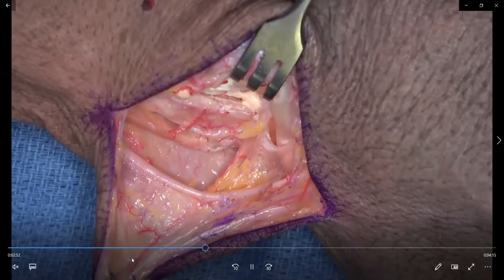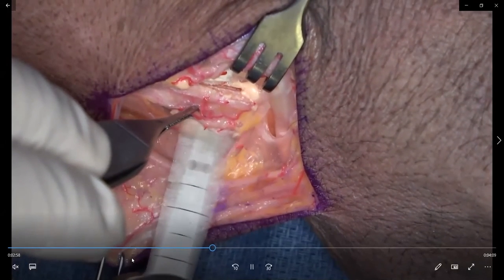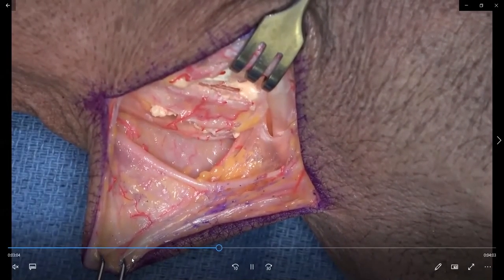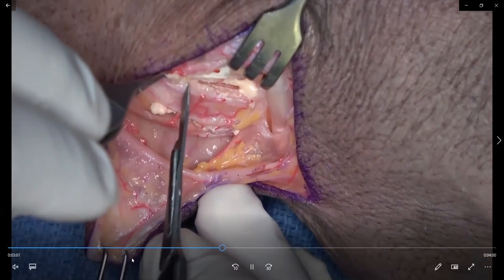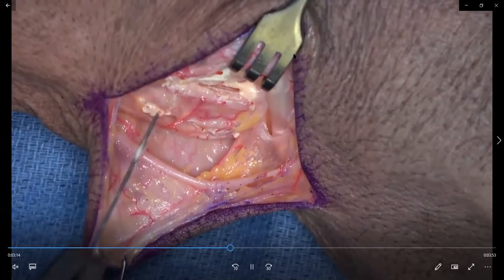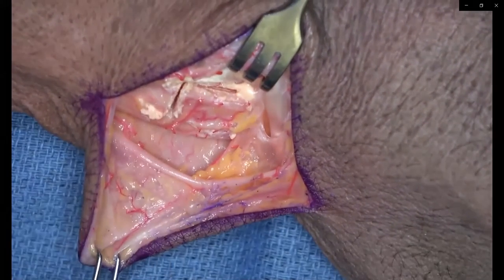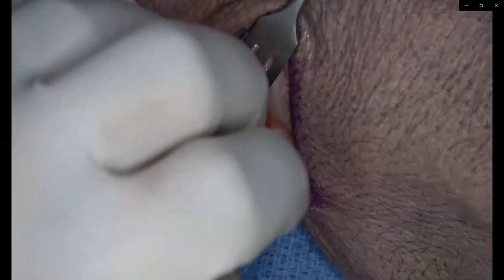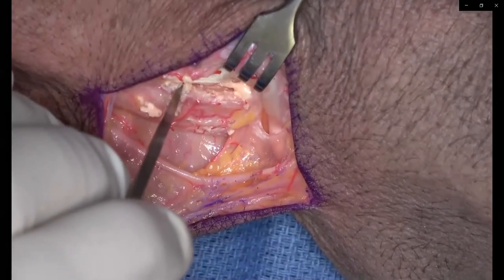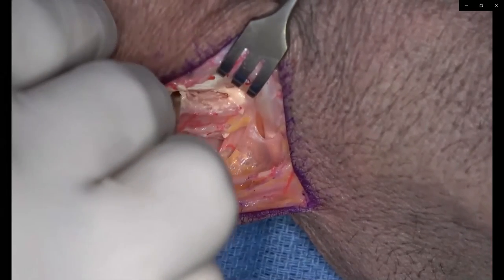You don't want to encroach on the vessels — leave as many perforators going down into the bone as possible. The compartments are elevated, the tendons are retracted, and that leaves you with a window of retinaculum between the retracted tendons with the vessels perched on top. The next step is to harvest the bone graft. I first start with a scalpel and make cuts rectangularly on the radial, ulnar, and proximal sides. You have to ligate those small vessels proximally.